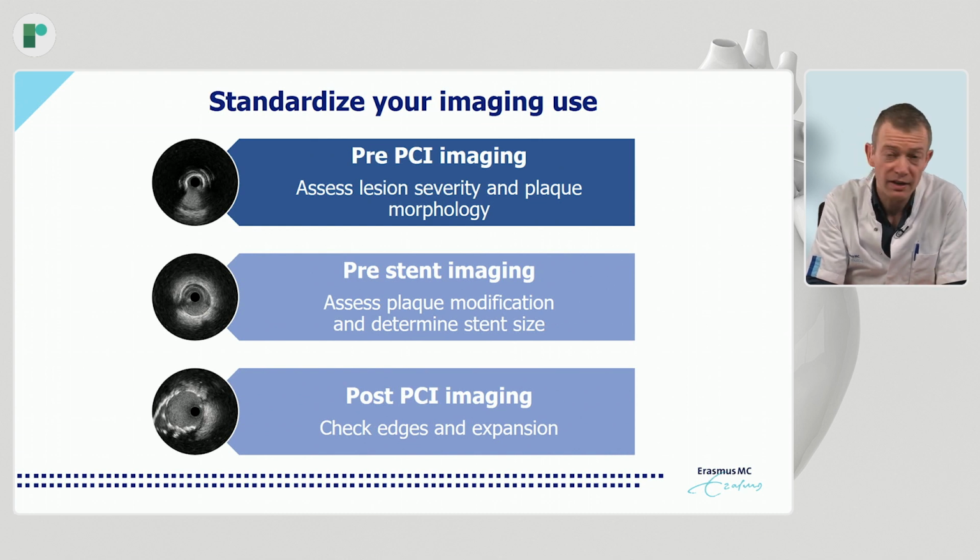So that just as a very simple takeaway, I always tell people, please print this simple workflow, put it on the wall of your cath lab and treat the imaging in each patient you do in the same standardized way. And whether you call that 1 to 3 essentials, MLD MAX, or whatever kind of commercial algorithm that will pop up, this is what you need to do in each of the individual cases in order to get the most out of imaging, irrespective of whether you use IVUS or OCT.